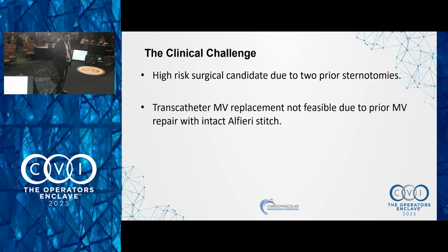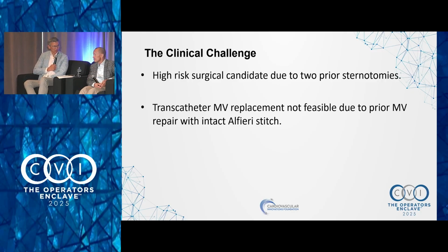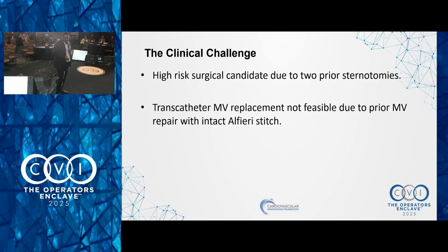I mean, nobody's very excited about that. And the literature shows they embolize, they can go down coronaries, there's a lot of leak and a lot of hemolysis. So, we also explored doing it, but the best thing is to just put a clip in if you can. Yeah, I think it's always a bailout, if you can't put a clip and you're stuck and there's no leaflet, that's the only time I would do it.